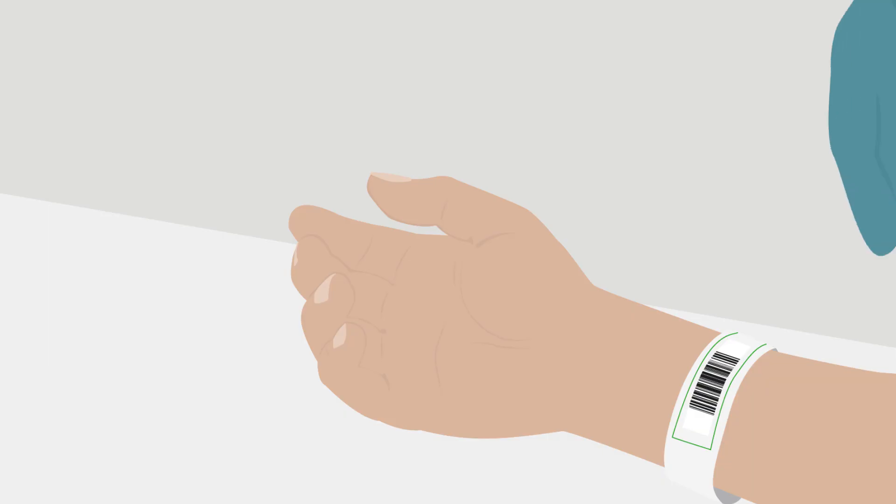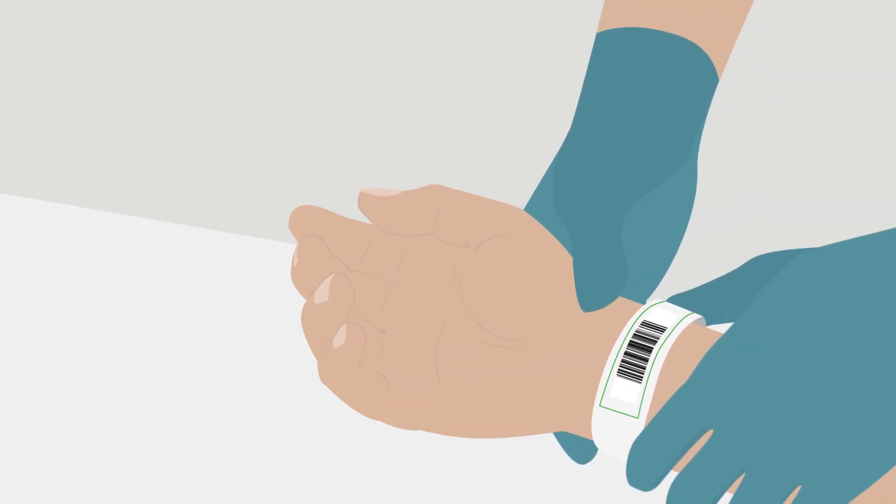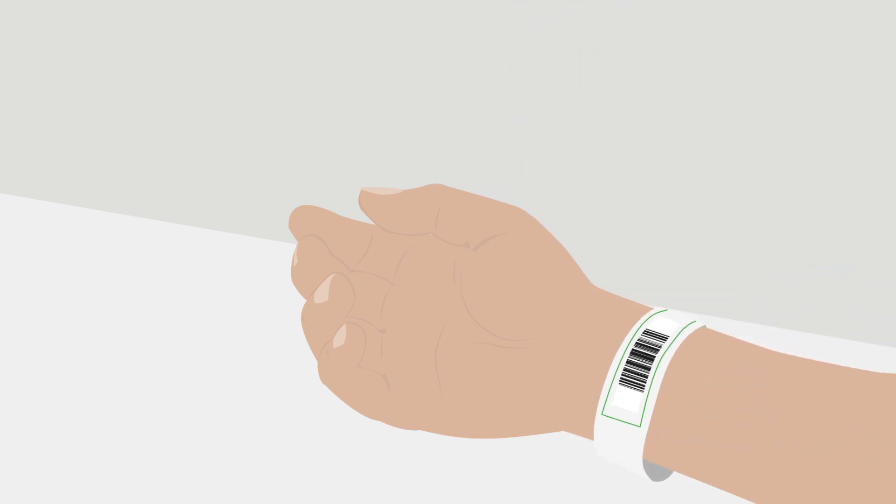Before performing the arterial puncture, confirm the patient's identity. If a recent change in the oxygen flow rate has been made, wait approximately 20 to 30 minutes before sampling. Then locate the radial artery.